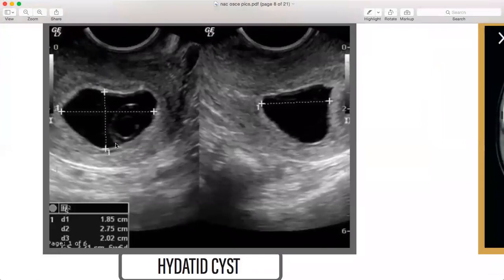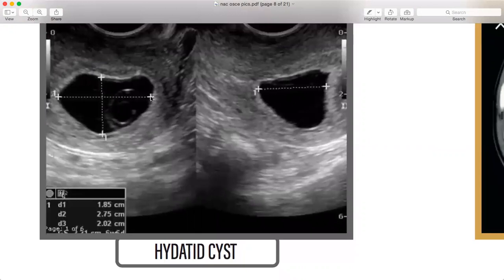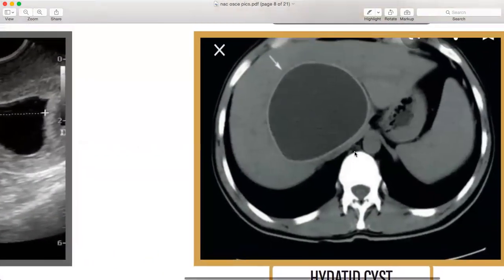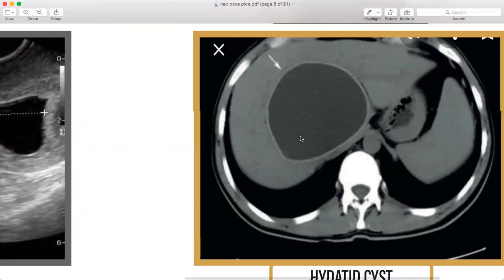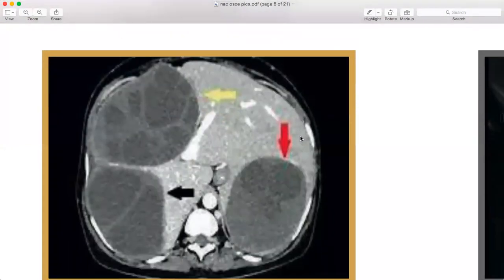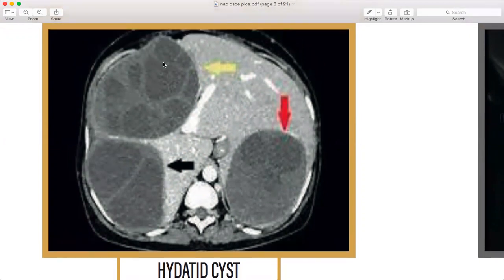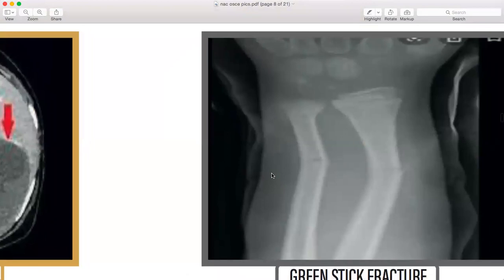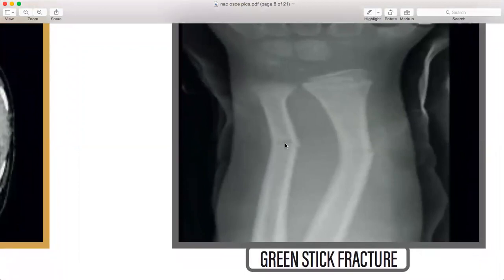Moving on, a hydatid cyst — also important. How does it look? It's a larger structure and will appear on both ultrasound and X-ray. Hydatid cyst is at the liver. Then greenstick fracture of a child — the bones are broken in a greenstick pattern. Very important to recognize.